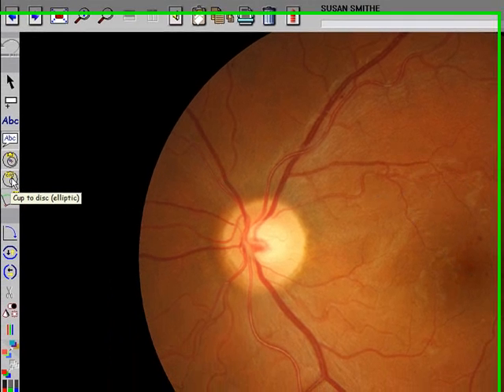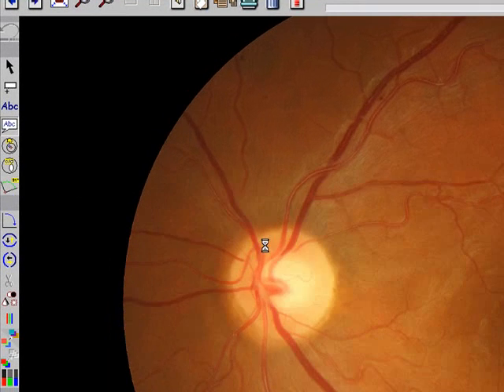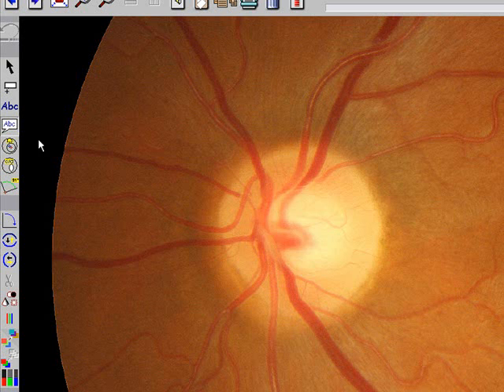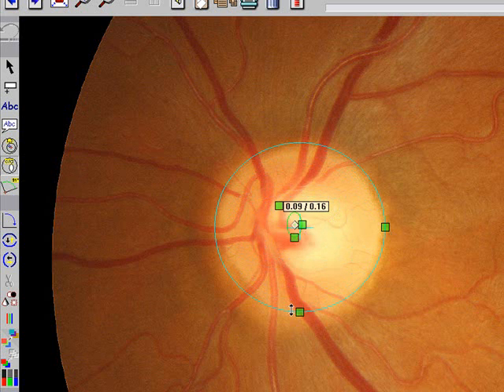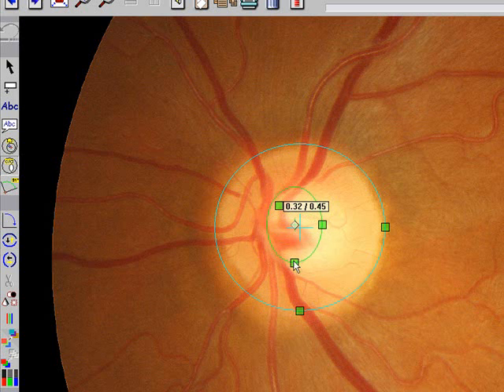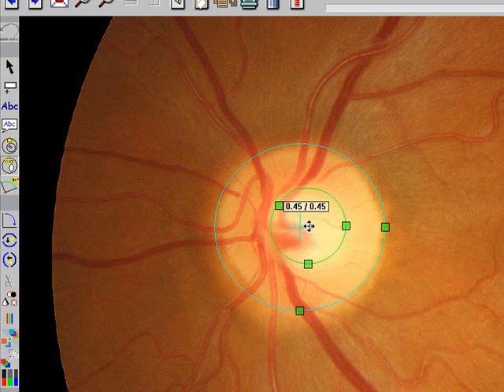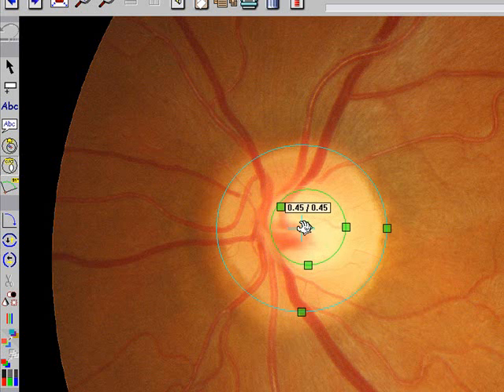To measure the disc cup ratio, zoom the image up and left-click on the CD tool. Left-click in the center of the image and drag the boxes — the outside box to be coincident with the outside of the disc, and the inside box to be coincident with the rim of the cup. If you need to move the circles, there is a diamond and an X: to move the cup circle, move the diamond, and to move the disc circle, move the X.